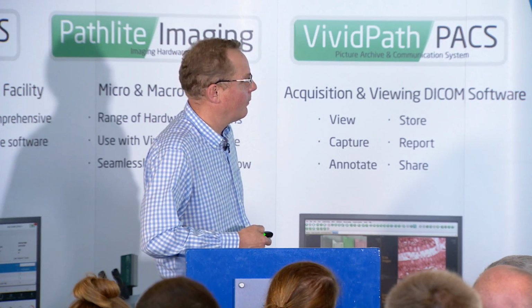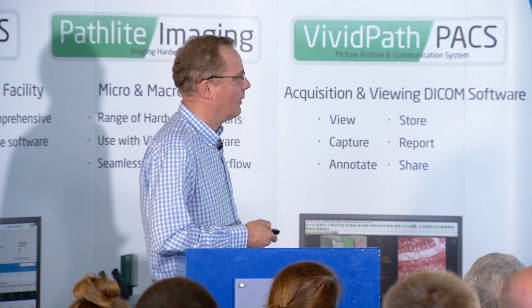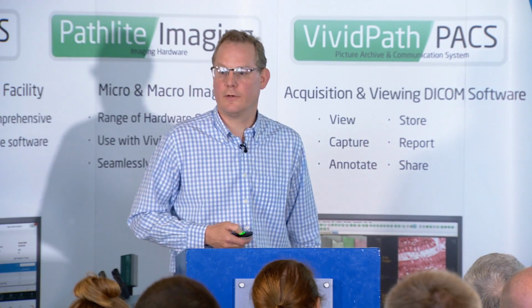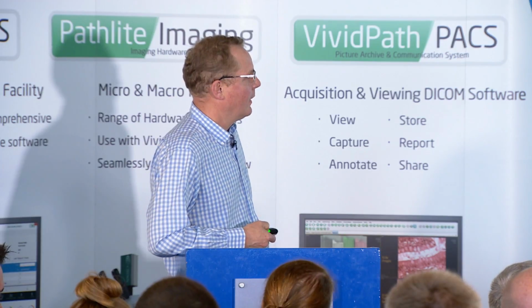PD-L1, program death ligand 1, is another marker which is emerging, or has emerged really, in lung cancer and emerging in other sites as well. The problem with this is that there are loads of antibodies. They all stain in a different way and require different analysis. So that's still quite a problem case to deal with.